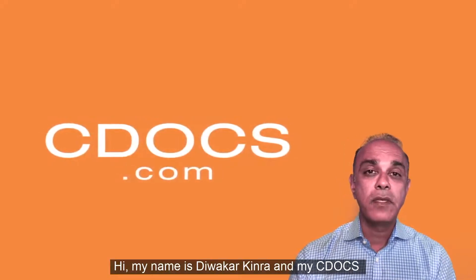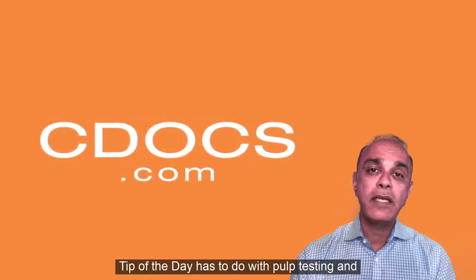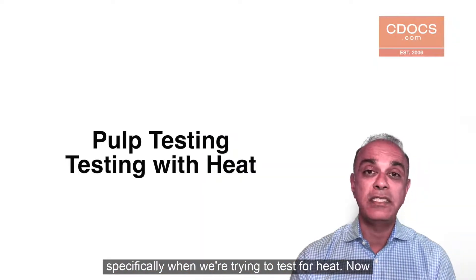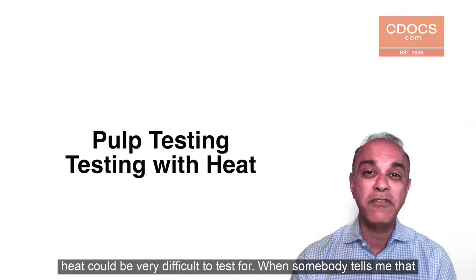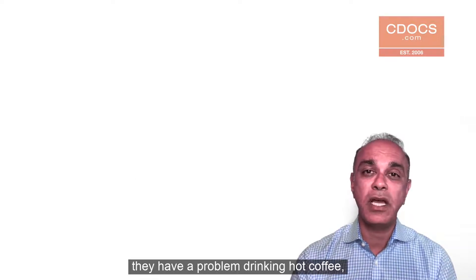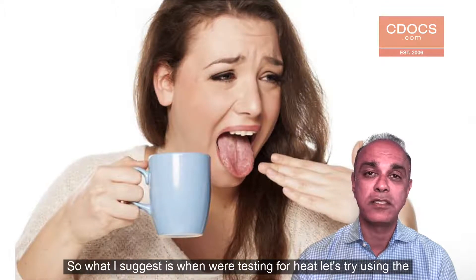Hi, my name is Devakar Kinra, and my C-Docs tip of the day has to do with pulp testing, and specifically when we're trying to test for heat. Now, heat can be very difficult to test for, and when somebody tells me that they have a problem drinking hot coffee, I want to get them back in action as soon as possible.